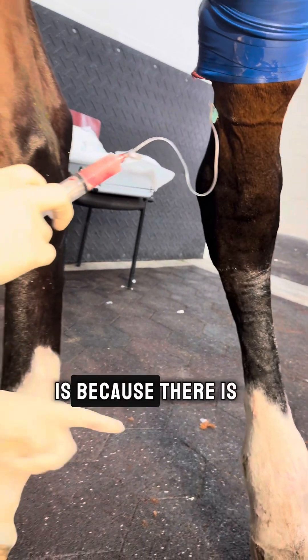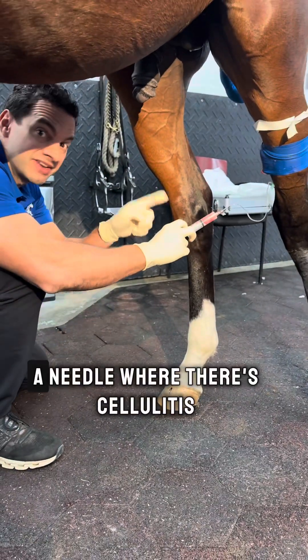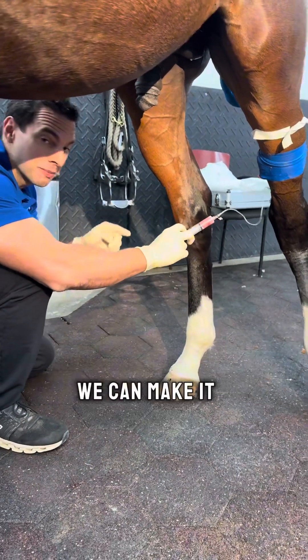The reason we don't put it in the digital vein is because there is a lot of cellulitis right there, and if we put a needle where there is cellulitis, we can make it worse.